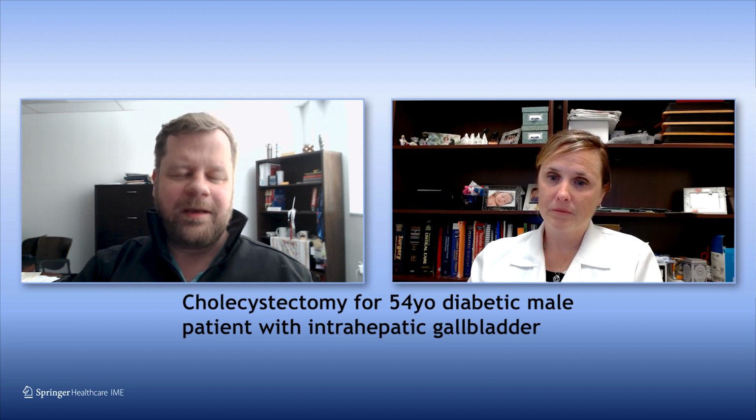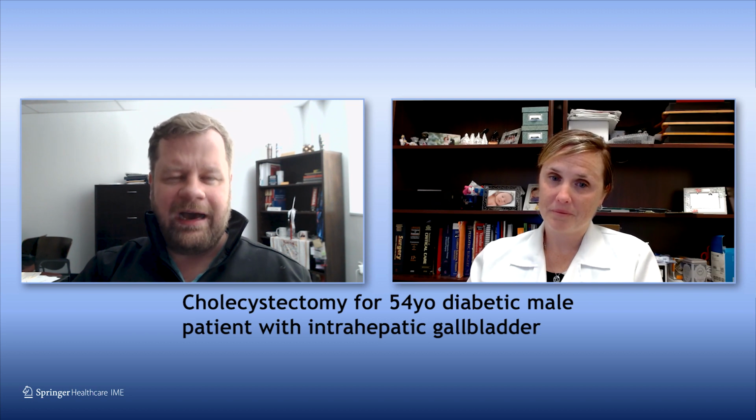So to summarize, my standard practice is, yes, I'll use what I have on hand, and I am both a flowable with FloSeal or Tisseel and a Surgicel or Nu-Knit kind of person. But I only do that if I really think it's a persistent problem. And that can be in gestalt sometimes, but otherwise, those are my go-tos for that type of procedure.